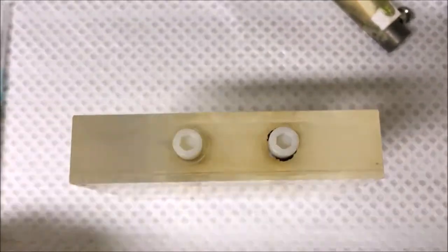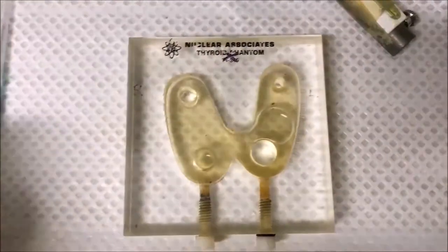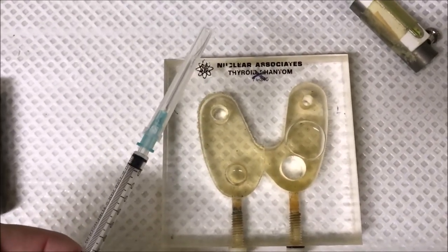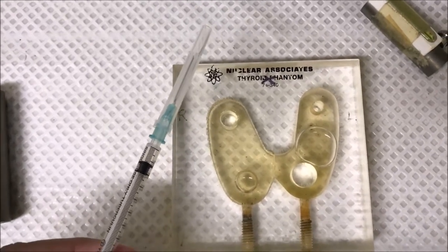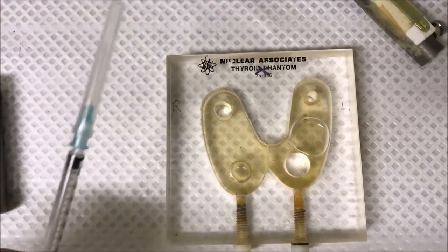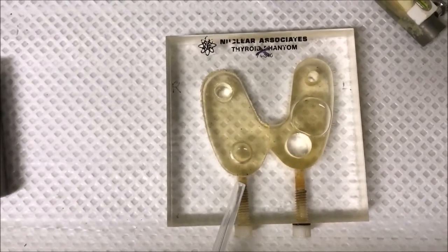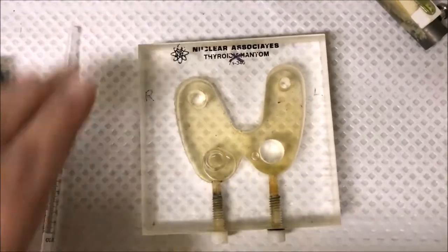We have a couple of ports on one side that we unscrew, and when we unscrew those, we can then administer the radiopharmaceutical. We'll draw up into a syringe the equivalent of about 3.5% uptake in the thyroid phantom of a 180 megabecquerel dose — so that's going to be 6 megabecquerels. We'll inject it into this port with some saline, mix it around with that air bubble, and then we'll remove the air bubble.